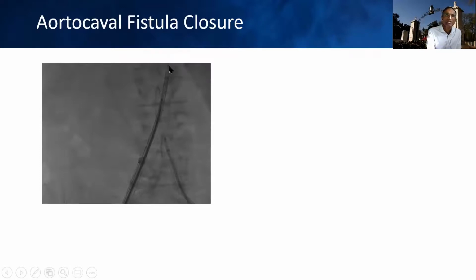Inside of this, you can just see the nose of it peeking out the top of the Agilis, we have a 10/8 Amplatzer ductal occluder that's been prepped and is waiting to go. The large sheath actually needs to be brought back fairly quickly. You don't want to dilly-dally and have the large bore sheath sitting in the space between the inferior vena cava and the abdominal aorta. You may ask why that is.